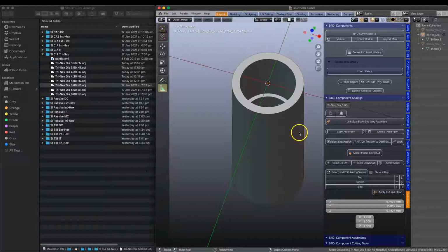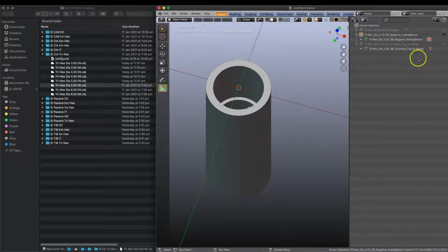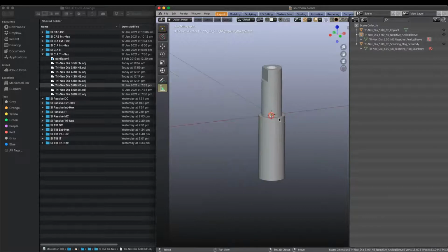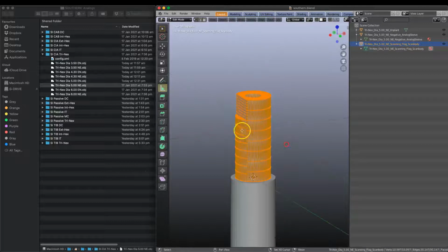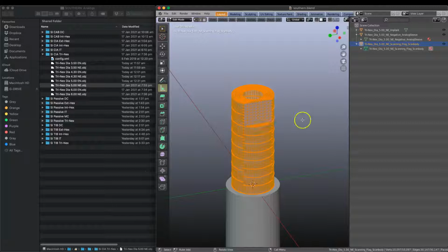Okay, so what we can do here is just expand the outliner window, and we're going to unhide our other components. If you have a look at the ScanBody, I'm going to just go into edit mode. This ScanBody has got many vertices, which is correct. I've come across other ScanBodies where, for example, the anti-rotation surface is just made up of one single face.